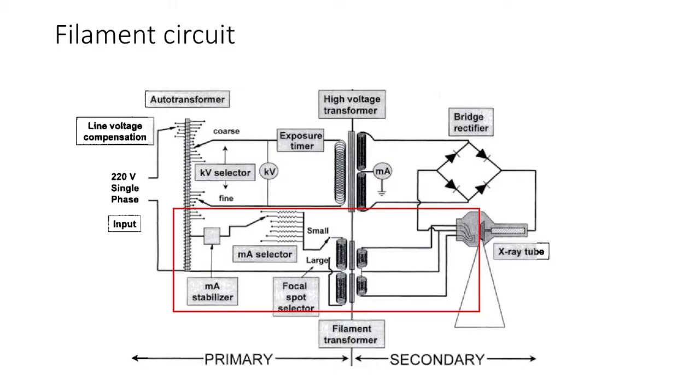Okay. It is also helpful to realize, this is just terminology, that this area that's boxed by the red box is also sometimes referred to as a filament circuit.